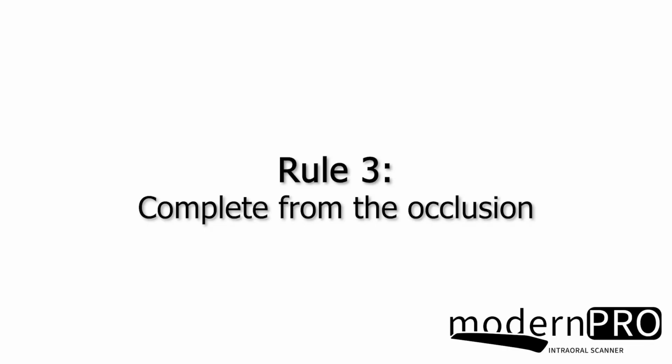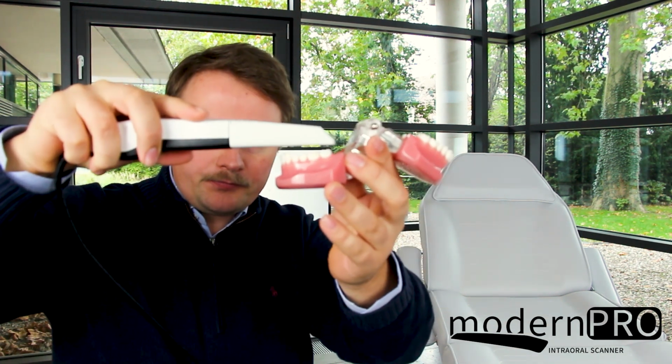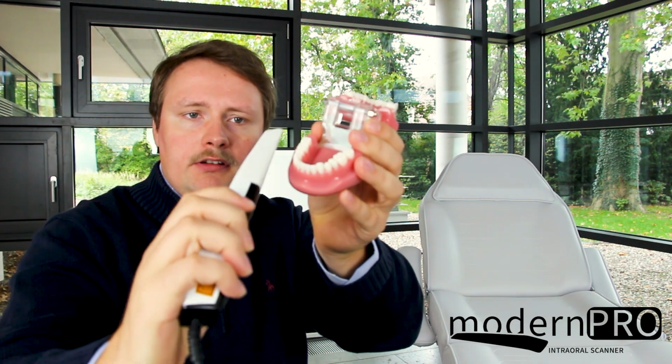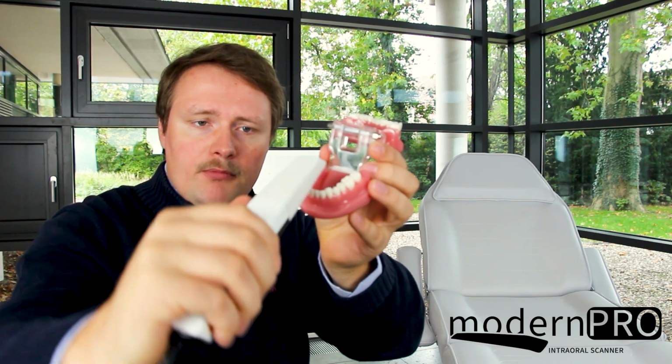Third rule: establish the connection between scanner and teeth always on the surface. From this surface on, complete the teeth, front and back, but always coming from the surface. Now I want to show you these rules in practice by scanning Josh.